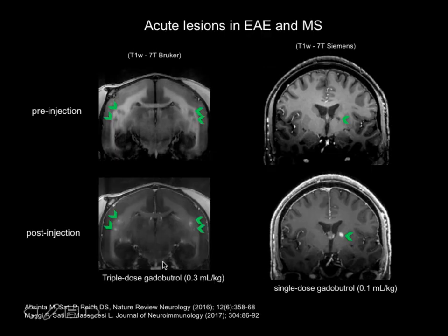And then if you do inject this contrast agent, the gadolinium, you will also see the same feature, that the blood-brain barrier is open after the cytokines or whatever is being released from the blood vessel attack the tissue. Then you start seeing these lesions that are taking up the GAD, that tells you that they're acute and active. And you see this in human, but you see this as well in the monkey, using the same imaging.